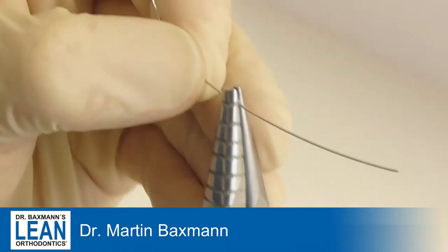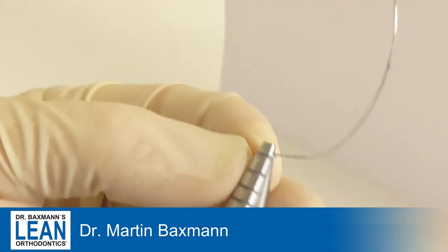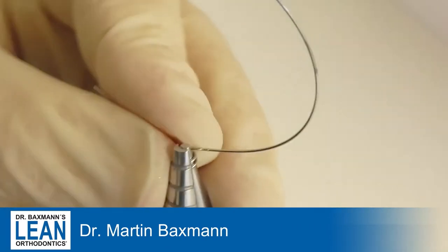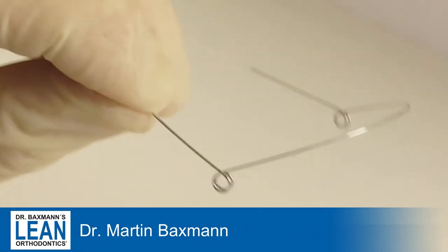Activation is 45 degrees, the same on the other side. That's the main difference to the cantilever wires — the cantilever wire is a segmented wire, whereas the intrusion and extrusion wires are full wires going from 6 to 6. So you can see: 45 degrees.